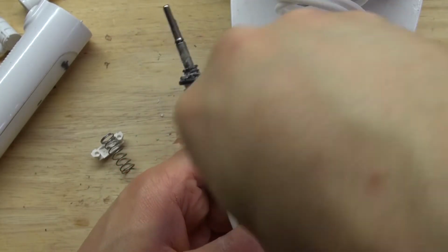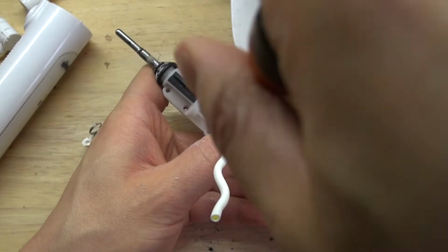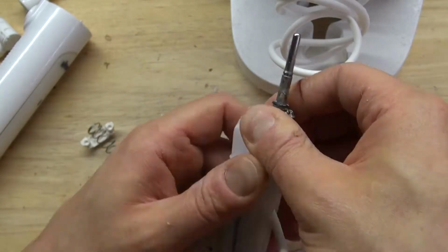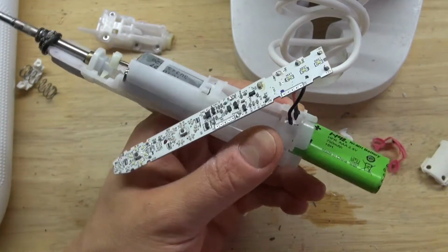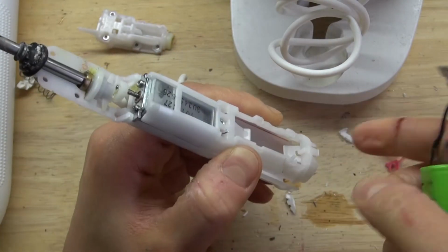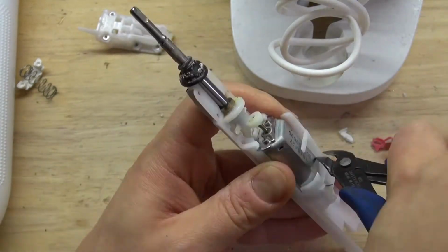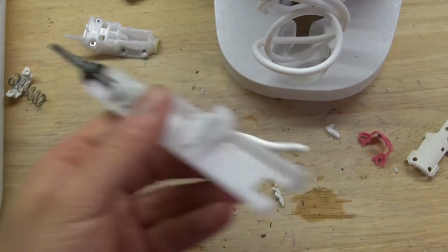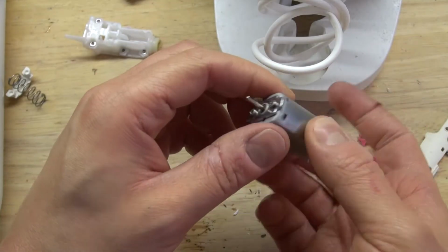And now let's go ahead and open up the housing a little bit more because I want to remove the rechargeable battery and remove the DC motor. And there, the DC motor is now removed. And there, the rest of this housing I can discard, and this DC motor is a very nice DC motor. Oh, and you can see the shaft is a little bit crooked. That allows a vibration to occur.